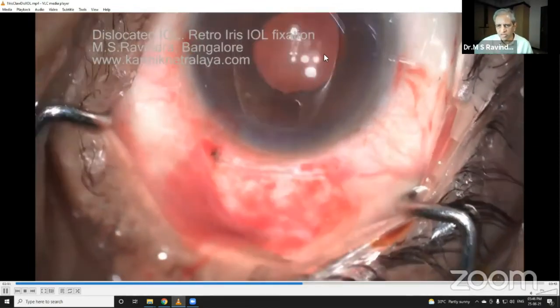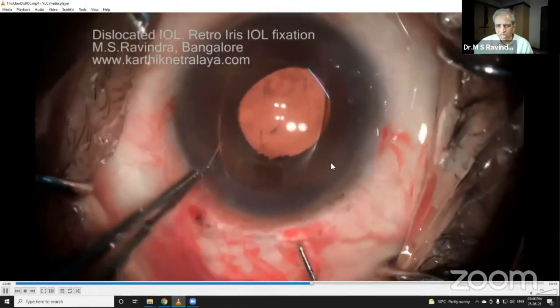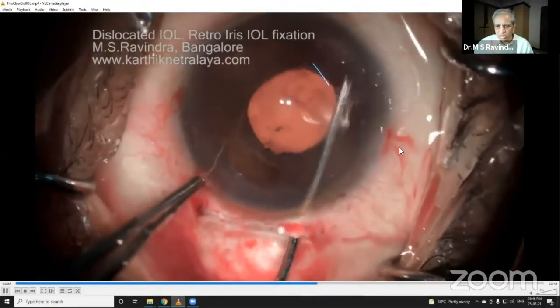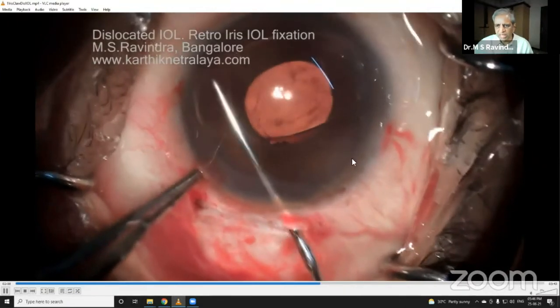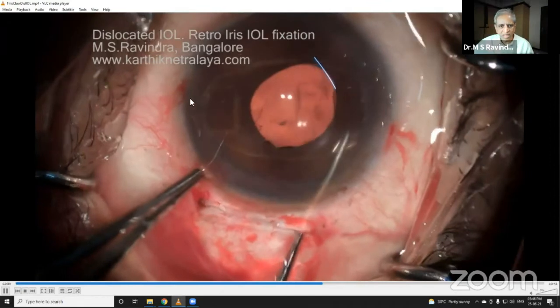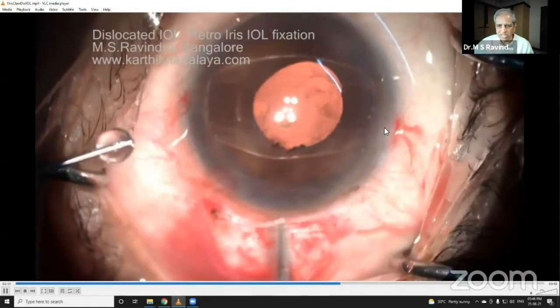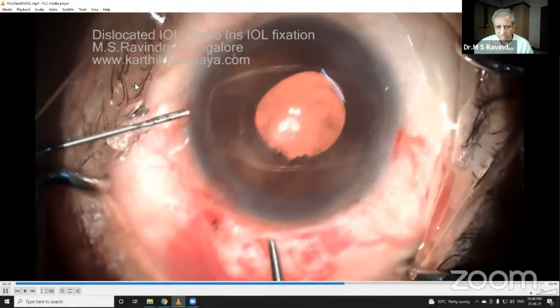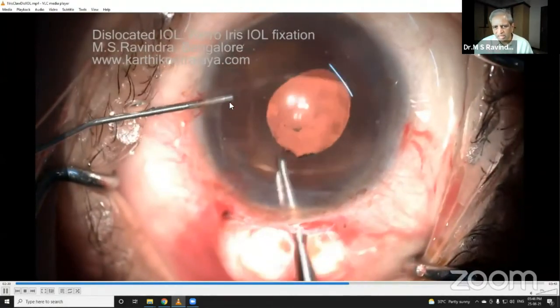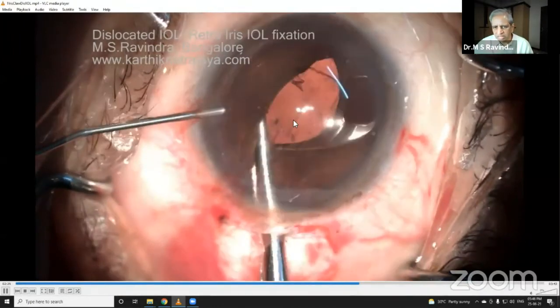Keep filling dispersive viscoelastic every time, then rotate it to the horizontal position — 90 degrees away from the main tunnel. I've already made short MVR entries with 21-gauge MVRs, and there's a 27-gauge cannula already in the anterior chamber. I'm holding the haptic-optic junction.